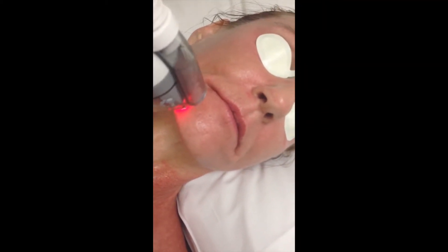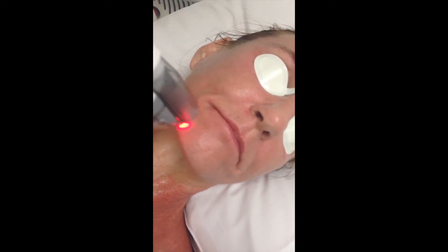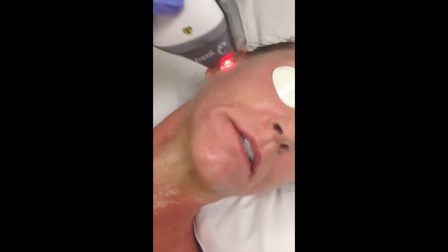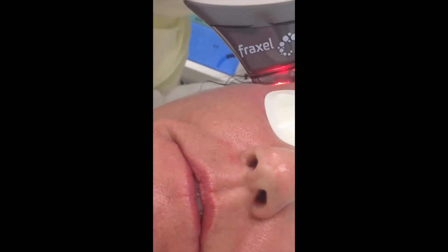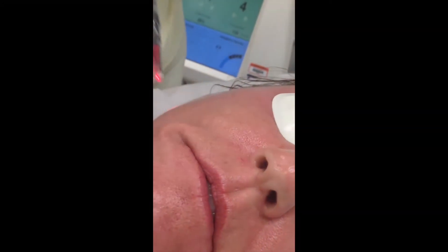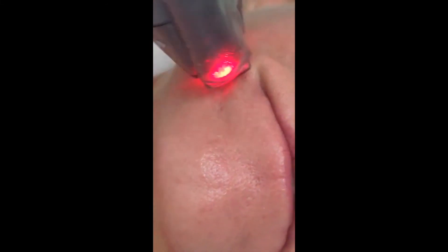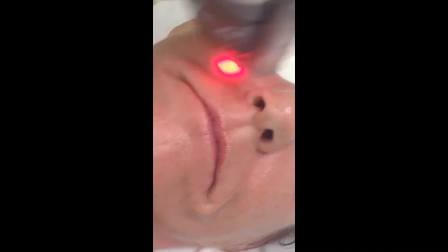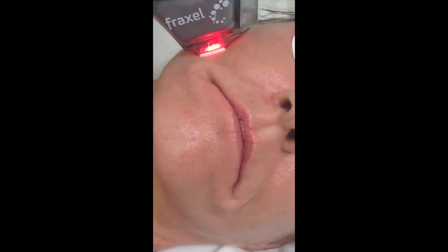How much did the 1550 hurt you from 0 to 10, 0 being nothing, 10 being excruciating? About a five. Now this is the 1927 — it's a different wavelength. How would you score this from a pain point of view? About the same. Most people will say it's somewhat less. But she had the topical anesthetic on for an hour, and that was about 20 minutes ago. Once you take the topical anesthetic off, it immediately starts to lose its effect. Everyone needs to be aware of that — you want to leave it on as long as you can and really only treat the area within five or ten minutes of having taken it off, otherwise it's going to hurt.